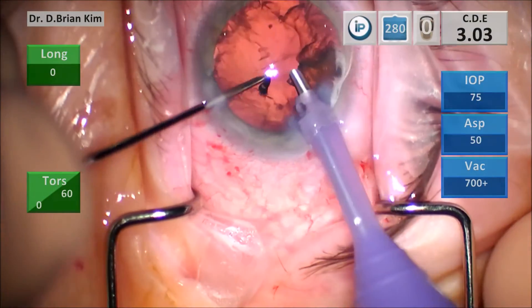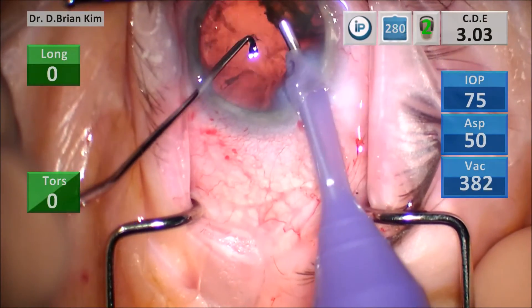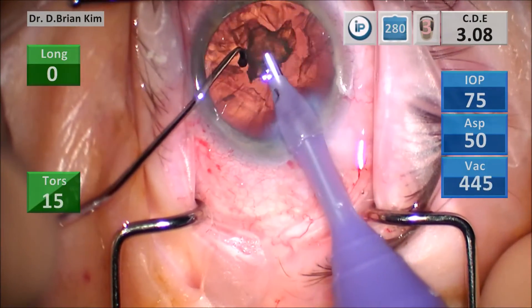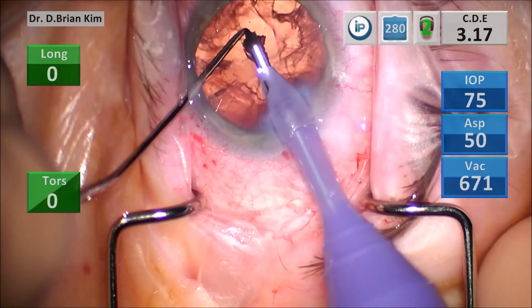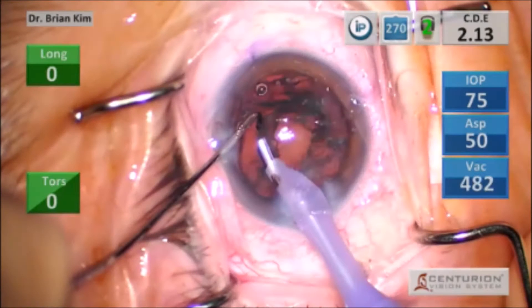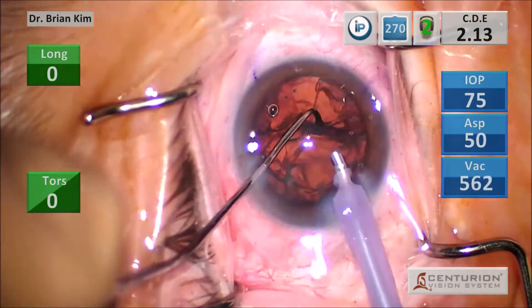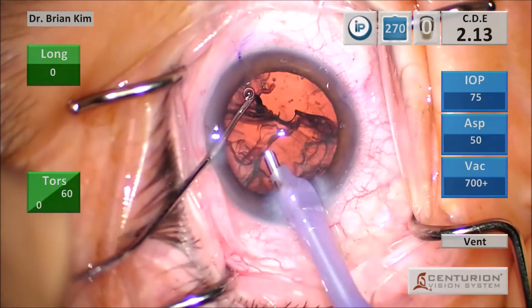This is an example of a mobile fragment that's difficult to reach with the phaco tip. I use the chopper to tease it in front of me and was able to emulsify easily. I didn't have to torque my hand and try to grab that piece with the phaco tip, which I think is a bad idea.